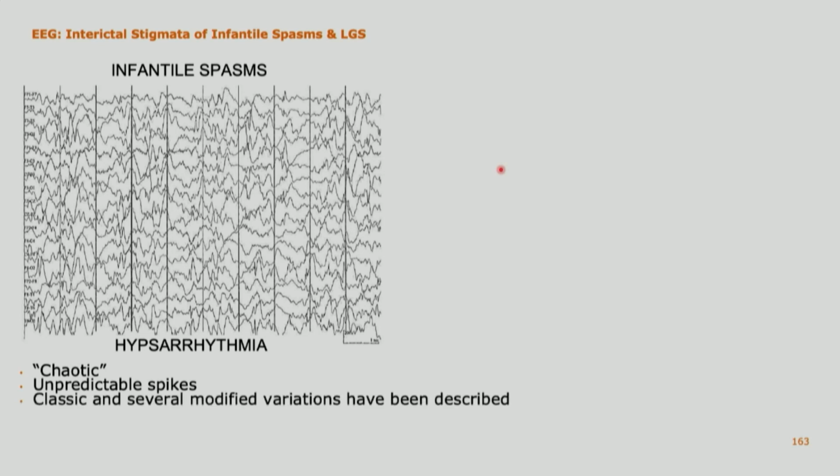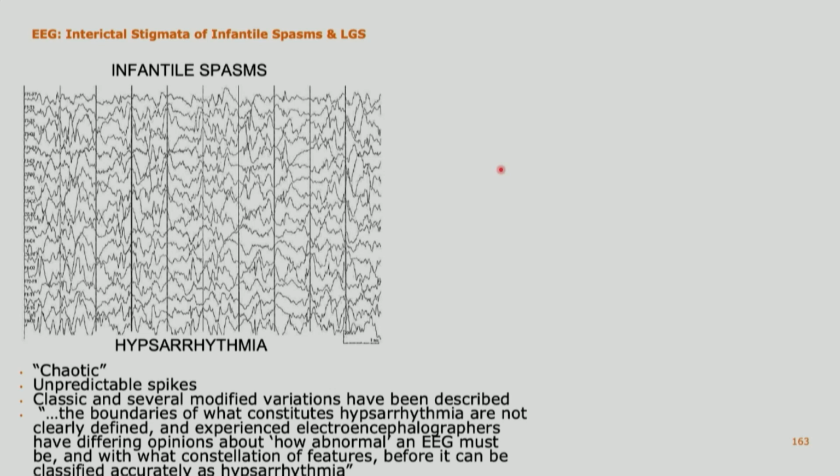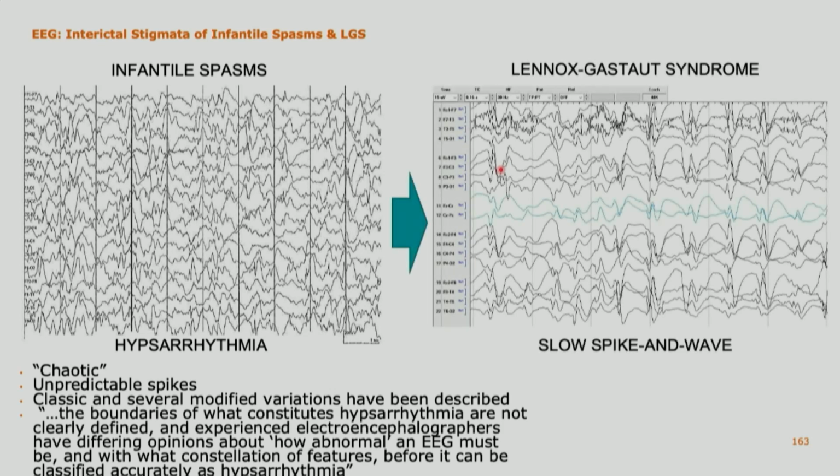But knowing that there's multiple versions of this, right? There's classic hypsarrhythmia, there's modified variations. And then we're pretty good as pediatric epileptologists on agreeing is there hypsarrhythmia or not, but in terms of grading it, how is this one worse than the other one? We've historically not agreed so well. And so a lot of work's been done with the BASED score and the revised BASED score to try to standardize how we can clinically grade the EEG in our kids with spasms.